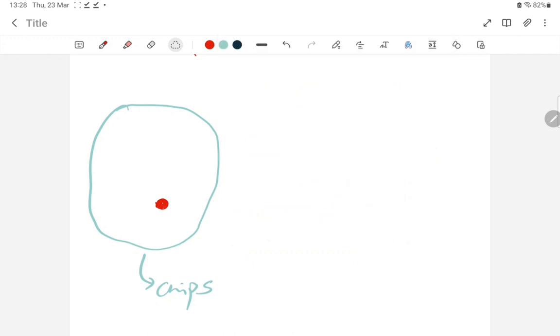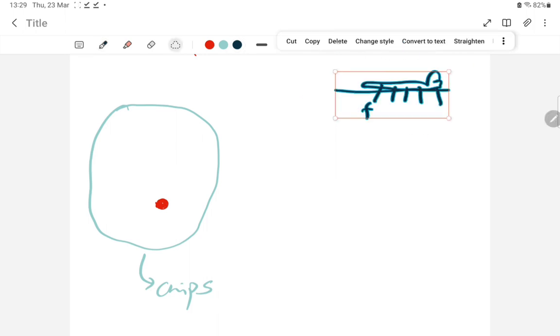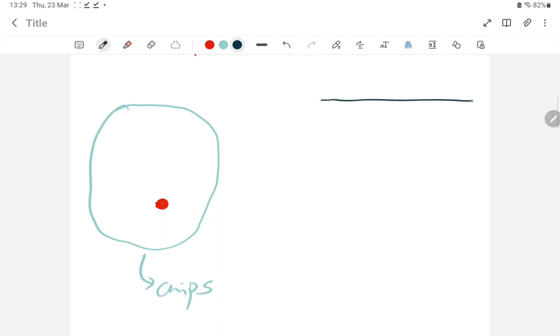Now you forget about the potato. Now you have your chips. Now what will happen? As I explained in the theory, each and every point of the patient's body is giving you a different frequency spectrum. But try to understand a very, very crucial point.